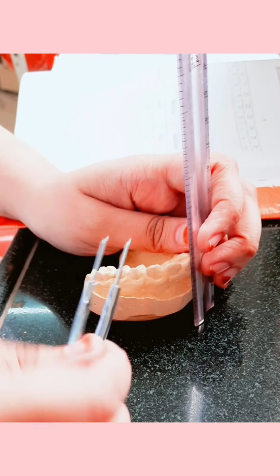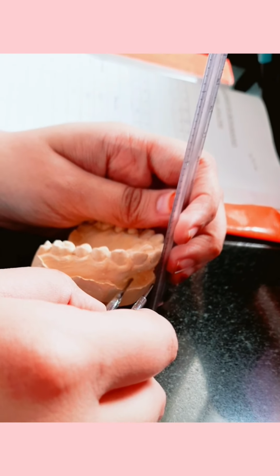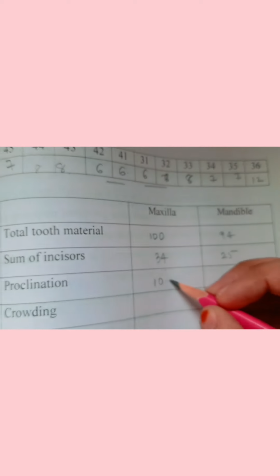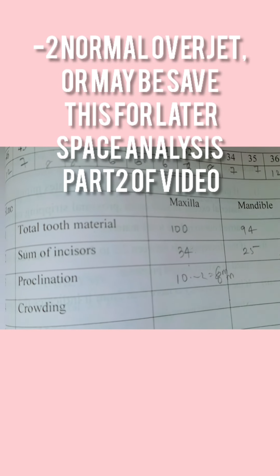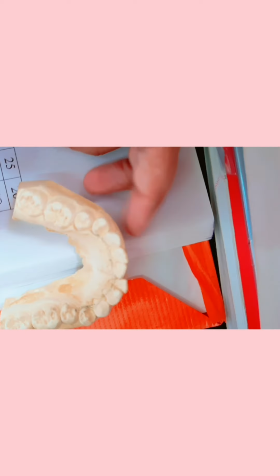Now we measure the maxillary proclination. So we keep the scale on the proclined anterior, the most proclined one, and from the deepest part of the sulcus to the scale, and with the help of divider we measure that and note the measurements in mm. So it is 10 mm, but we do minus 2 because normal overjet is 2 mm. So we subtract the normal one from it, that is our proclination is 8 mm.